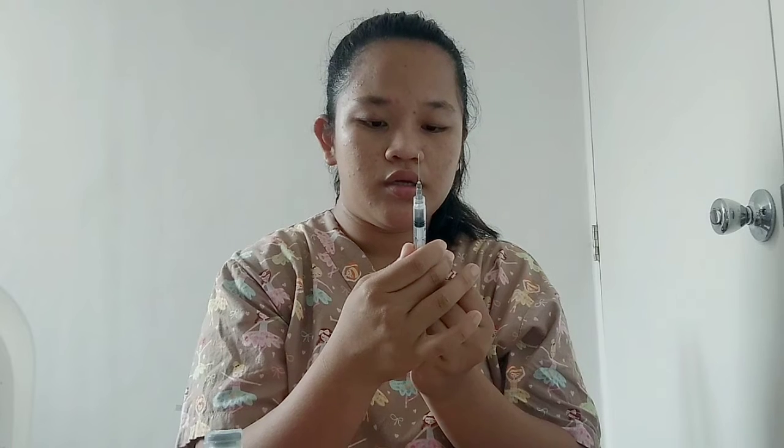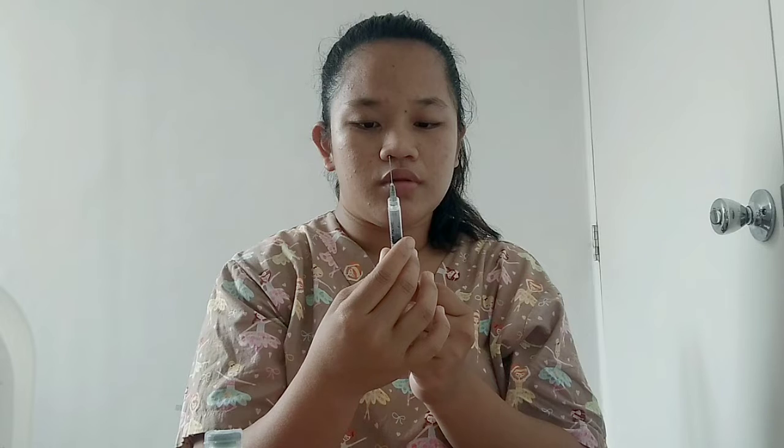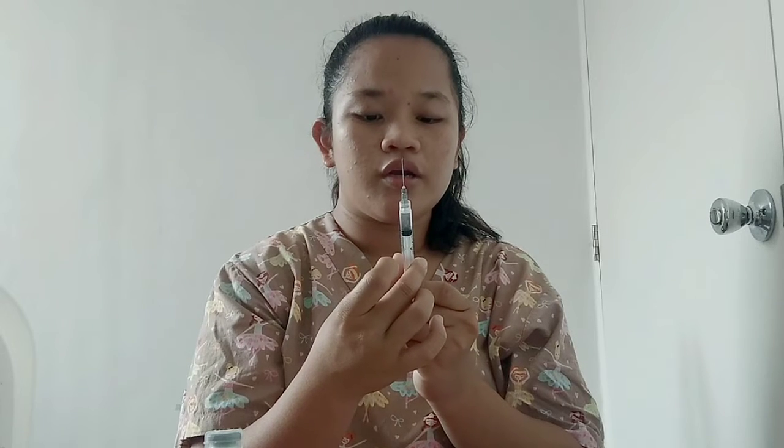Then we are going to get the syringe and uncap it, and we are going to draw in air with the exact amount of medication that we need. Let's assume that we will be needing 1 ml of medication.